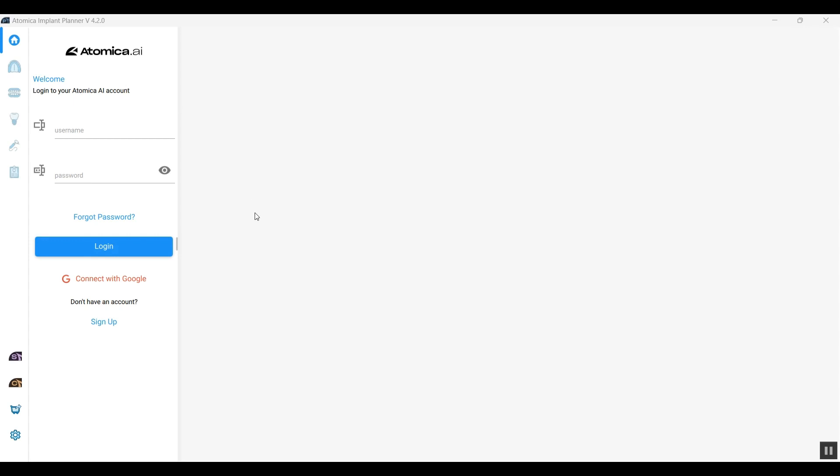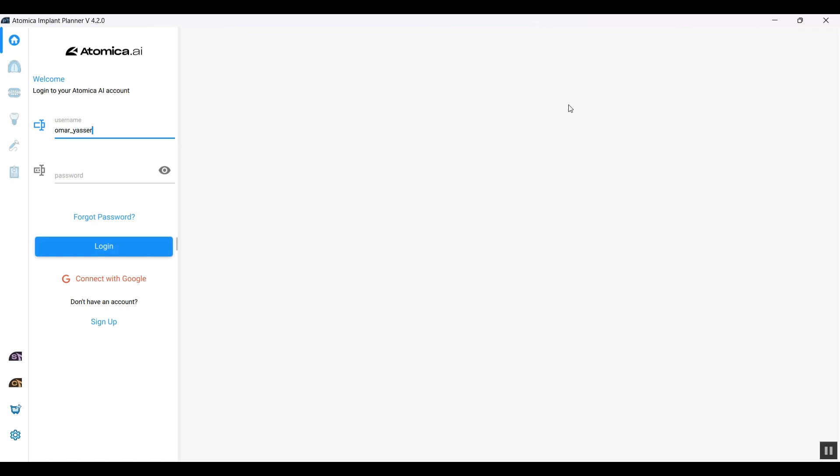Before starting, all you need to do is sign up to have access to the software. You can sign up using your personal email or connect with Google and have access to the software right away. Let's go ahead and sign in using my credentials.